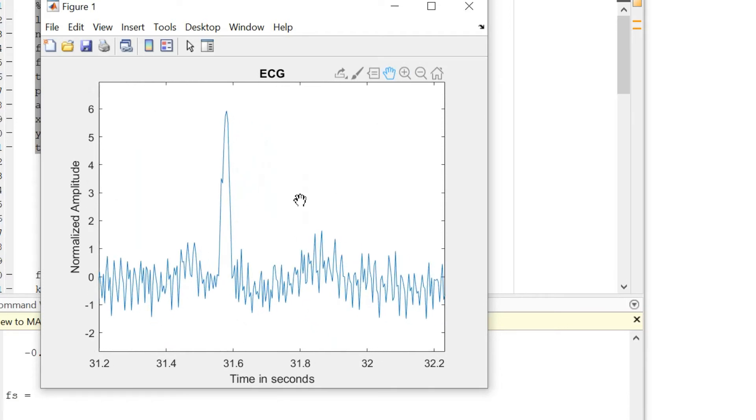Over here there is a simple comparison that you can make with the previous diagram that I had showed you.